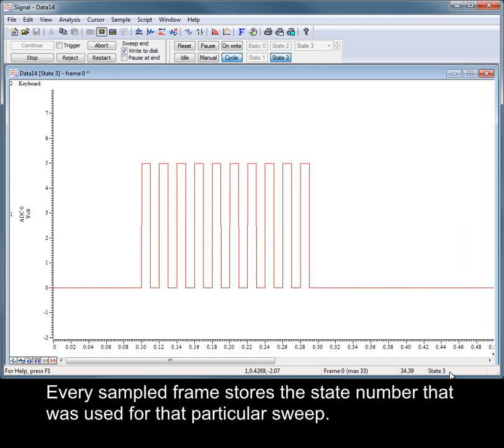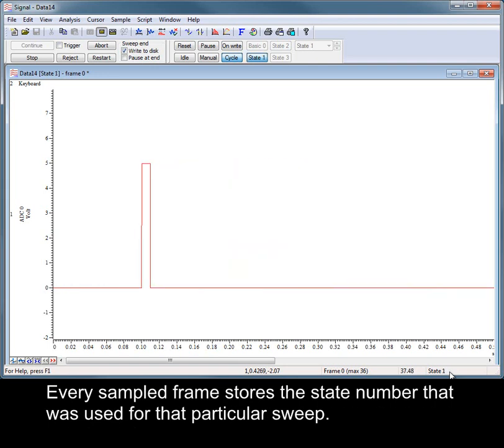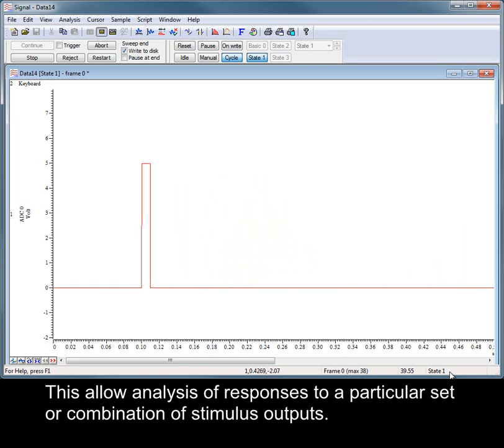Every sampled frame stores the state number that was used for that particular sweep. This allows analysis of responses to a particular set or combination of stimulus outputs.